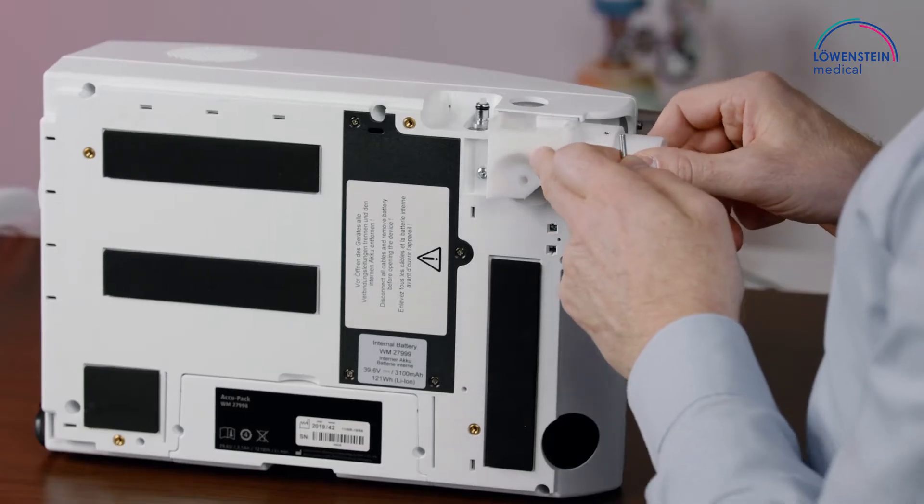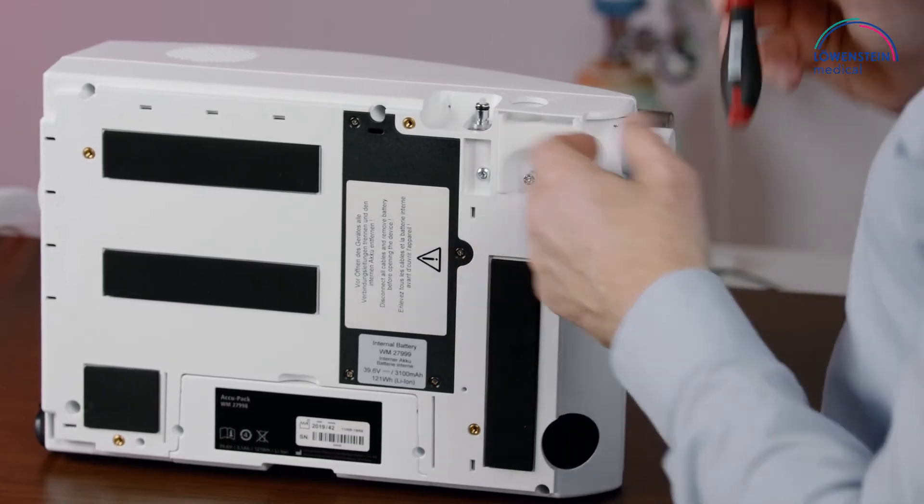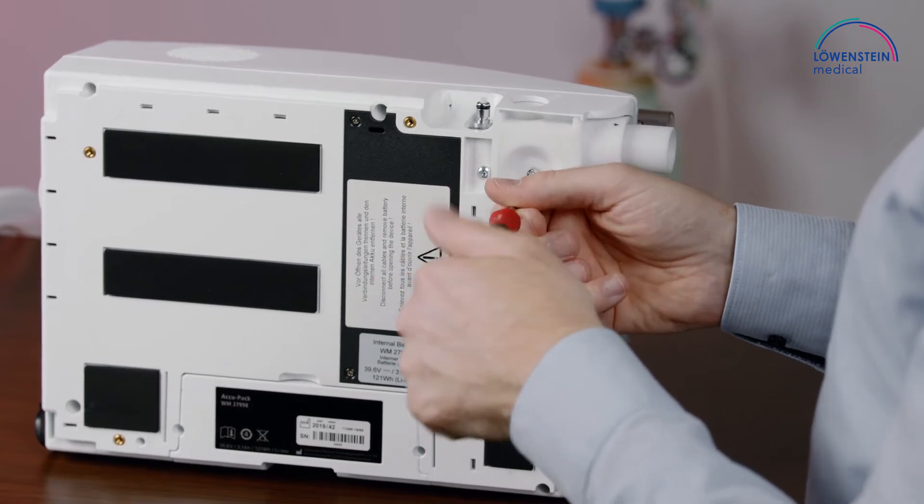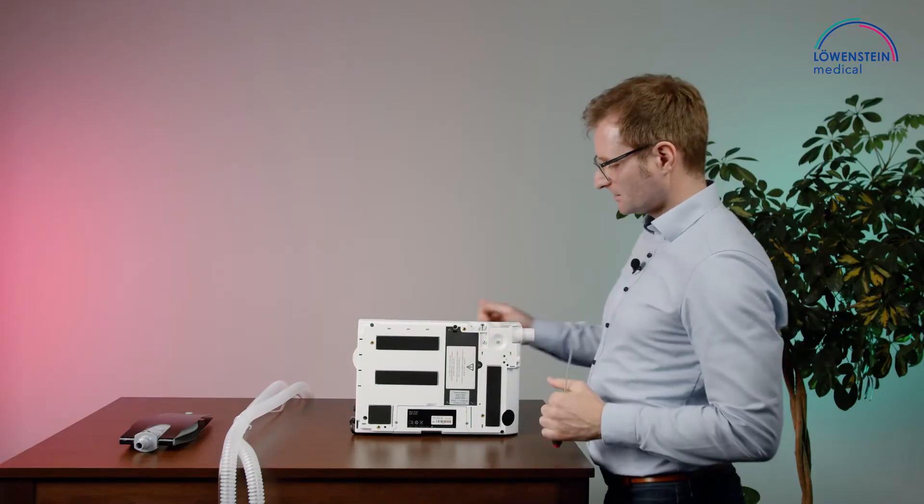The module only fits in one position. Tighten the screw to secure it.